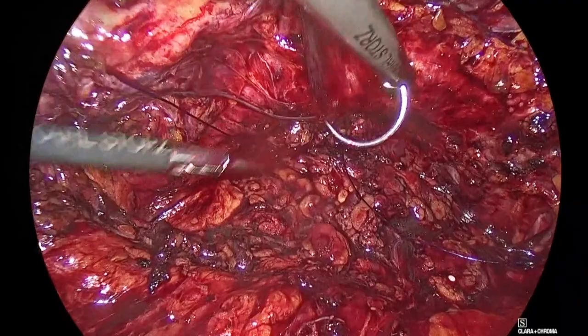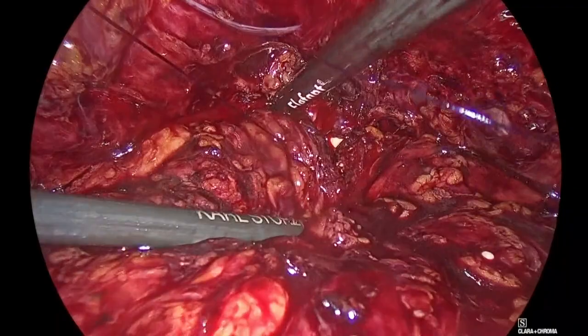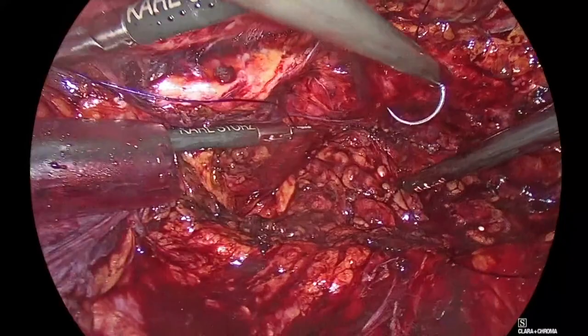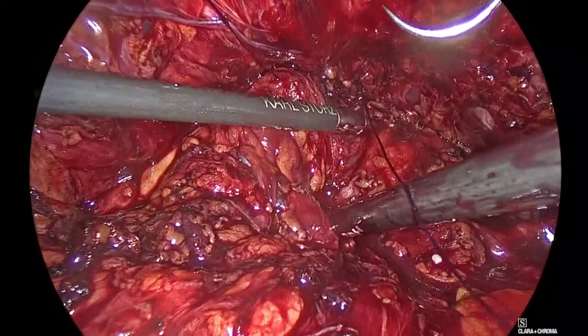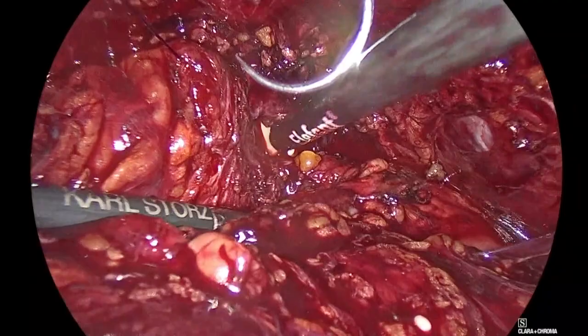Aspirate. Panagiotis, it is not tight. This is loose. Get it lower down. Panagiotis, grasp it lower down. Good. Excellent. Let's go. Good. Aspirate, please. Good, go. Padeli, you're rotated.